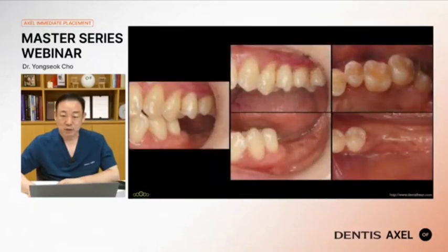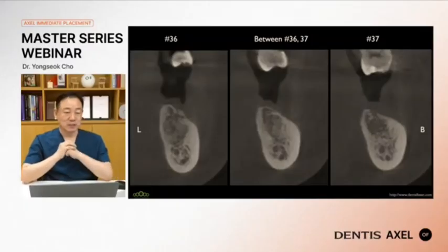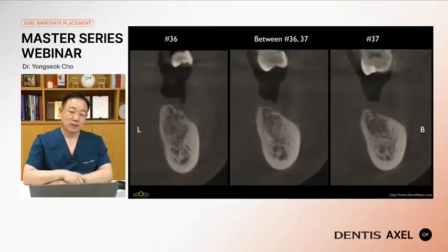And the intraoral picture shows buccal bone resorption. In the CT view, I found relatively severe buccal bone resorption in this case. So I planned buccal GBR in this case. Although this is not mandatory, generally I do very simple surgery at the mandibular posterior molar site, so I have very rare cases of GBR. So I want to make some GBR cases. Maybe this is not a bad indication.